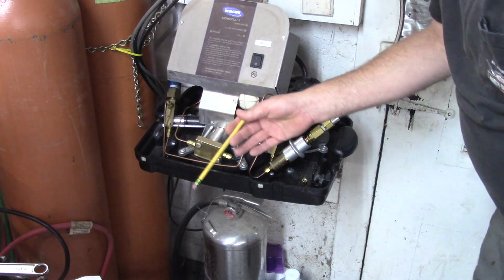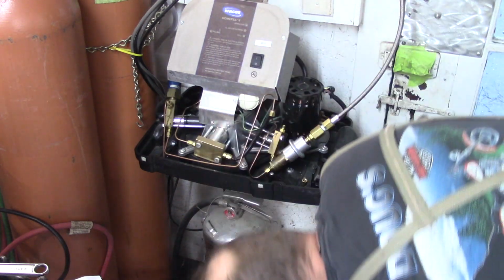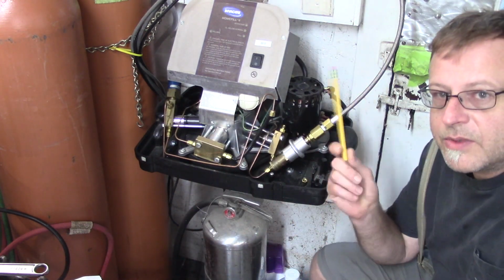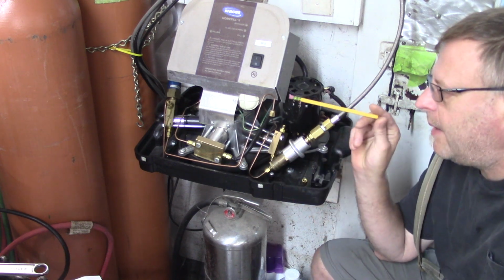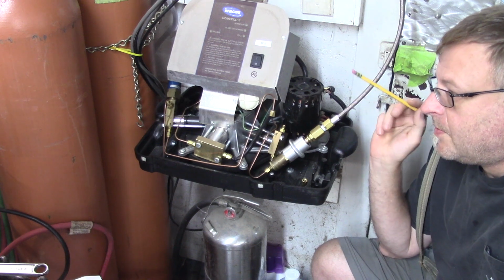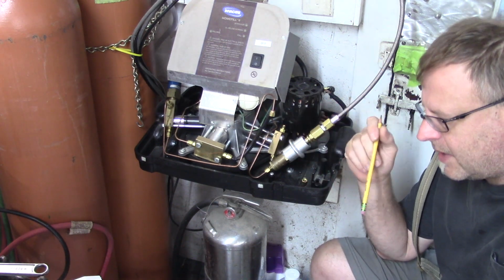What's the result of that? Well, the result is the machine still works, but it doesn't work properly. There's a couple problems with doing what I did, and I'm going to go over those real quick because it's just the way things work.